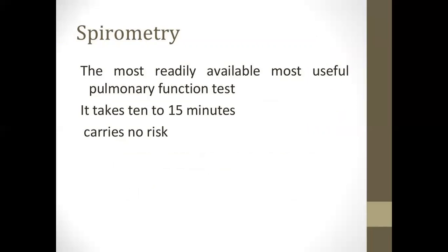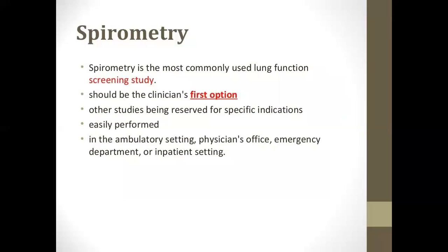The most readily available, most useful pulmonary function test, it takes 10 to 15 minutes and carries no risk. Spirometry is the most commonly used lung function screening study.